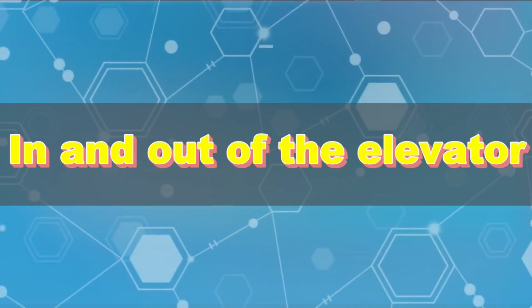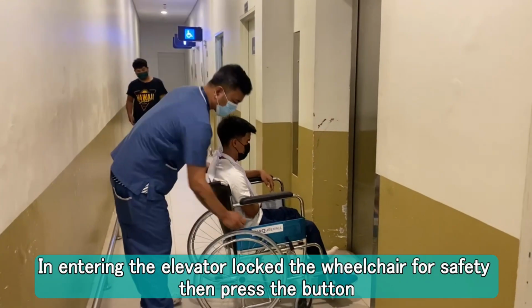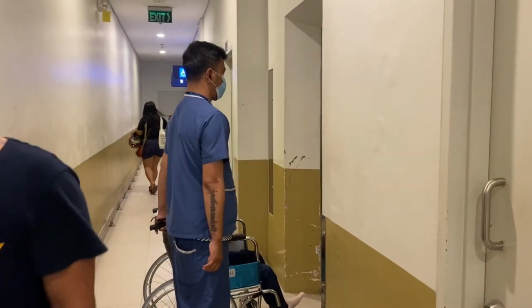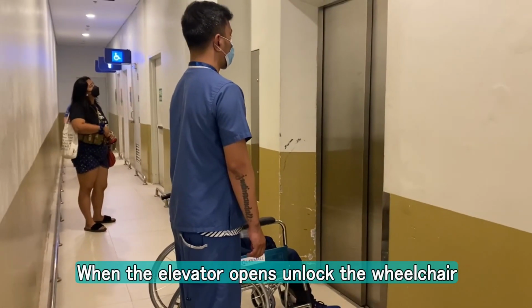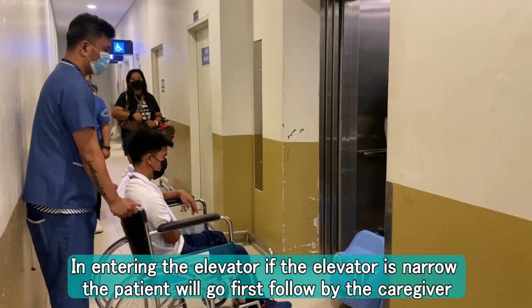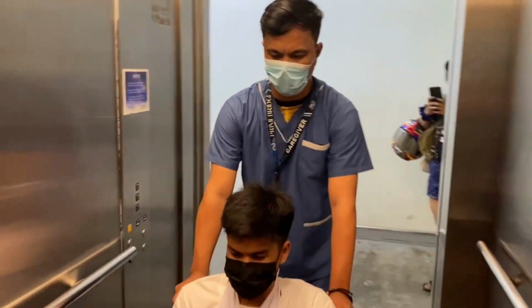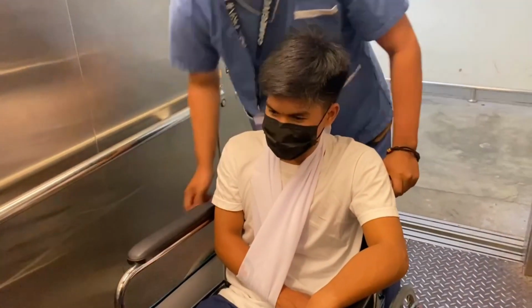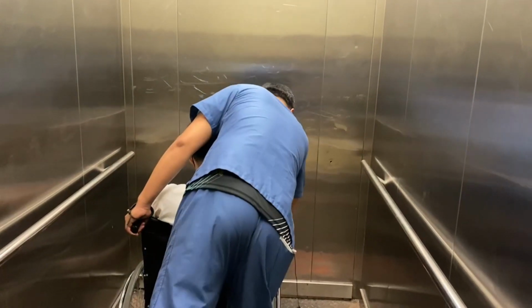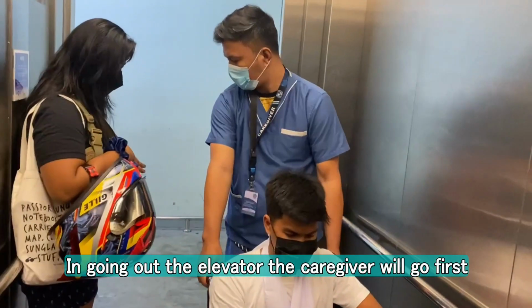In and out of the elevator. In entering the elevator, lock the wheelchair for safety, then press the button. When the elevator opens, unlock the wheelchair. If the elevator is narrow, the patient will go first, followed by the caregiver. In going out of the elevator, the caregiver will go first.